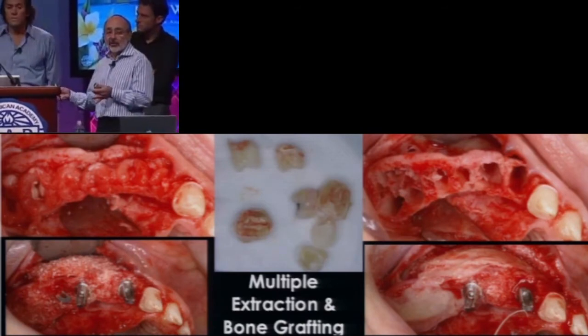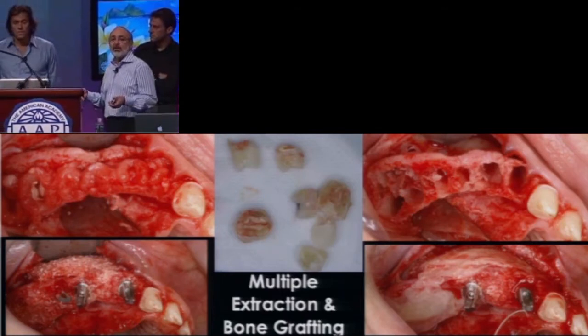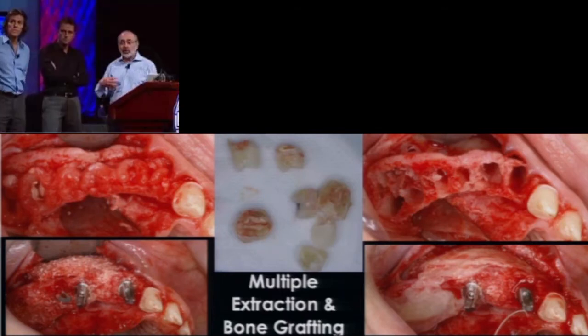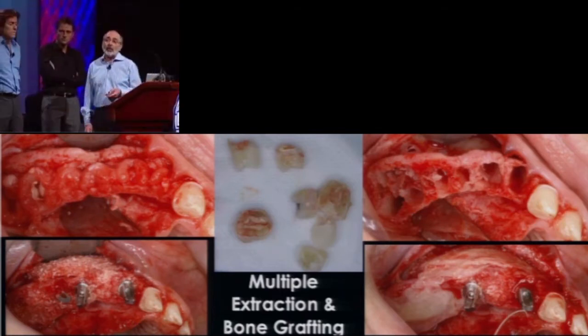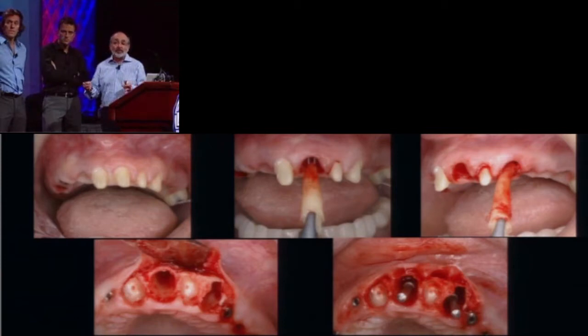Which teeth to replace? Where do we put the implants? How many implants do we actually need? What's best for this patient? I'm showing you the different ways we can go about this process. And you can see that over here, as we're taking teeth out, that we're choosing to place the implants.